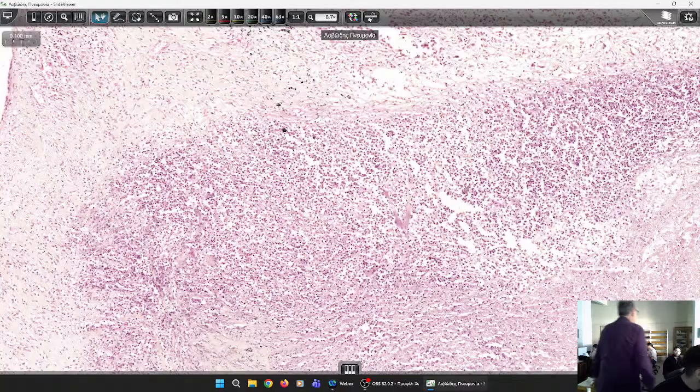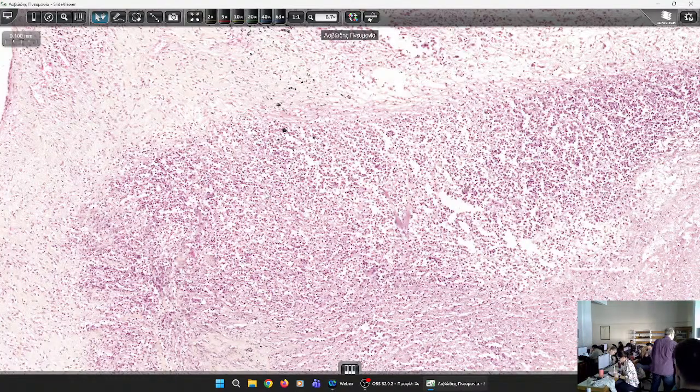How is this complication formed? Called? Yes, this is an abscess. An abscess. So this is a complication of pneumonia that formed a collection of pus within a cyst-like structure, a cavity, which is surrounded by fibrous tissue. And if you give antibiotics to treat the streptococcus, they cannot reach the area where the microbes are because there is not enough blood supply in this area.